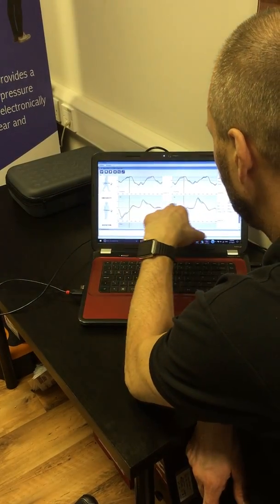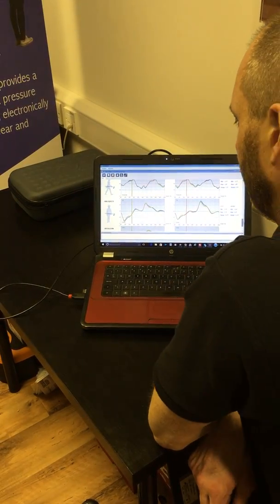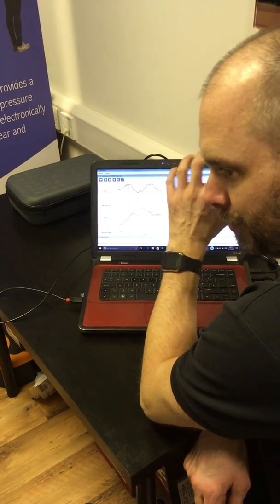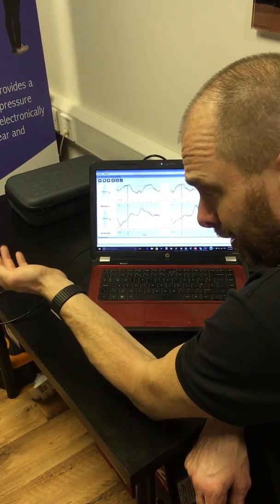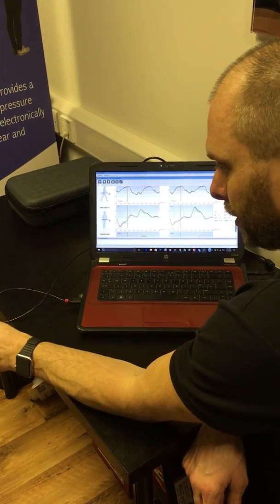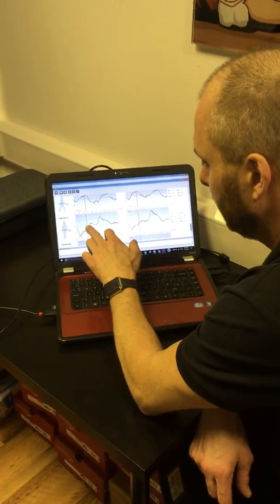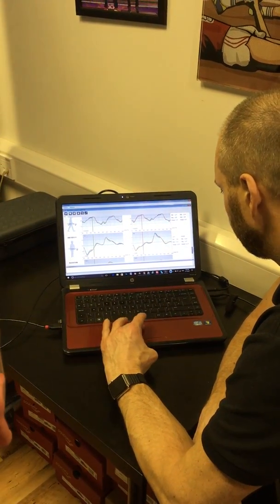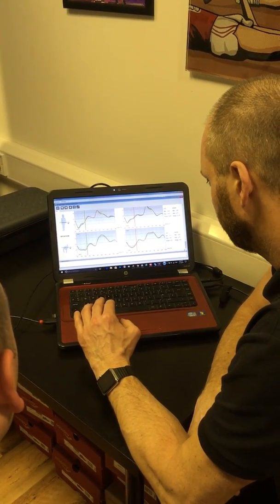But we do have a big difference. We have some difference in what's going on from left to right. And that's going to come down to these subtle differences, which actually make quite a big difference to what's going on with your gait. The pressure you're putting through your left foot is gargantuan compared to what's going on with the right foot. And we need to try and address what's going on at the foot plate without doing anything negative to this, because we're already on the cusp and actually looking to rectify that. And the last thing is looking at your rotation.